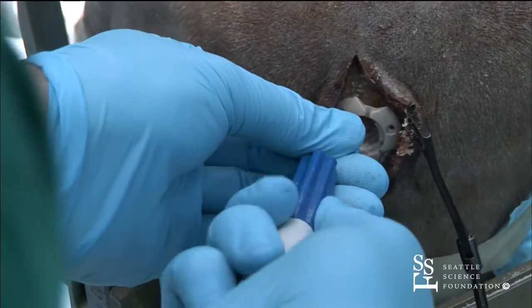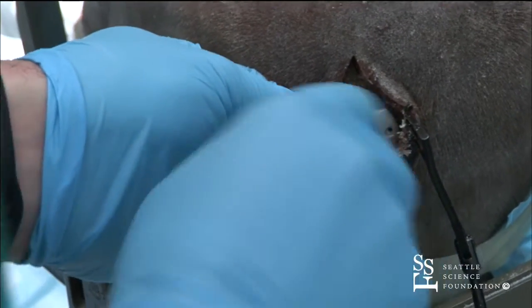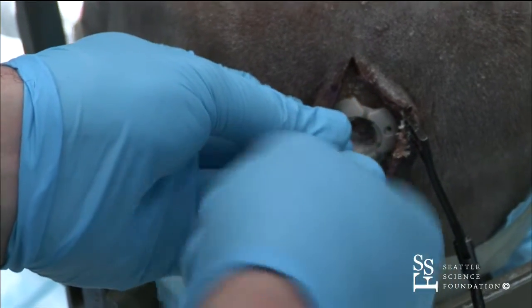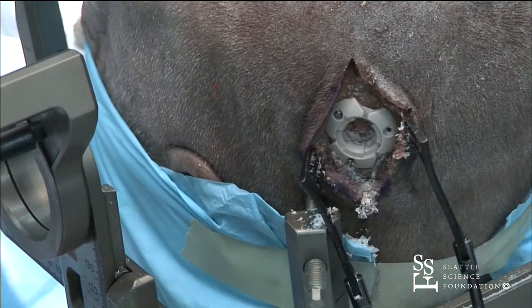And I typically use about a 4mm tie mesh screw for these burr hole covers. So we don't have quite enough screws here, so we'll stop at 2 here.